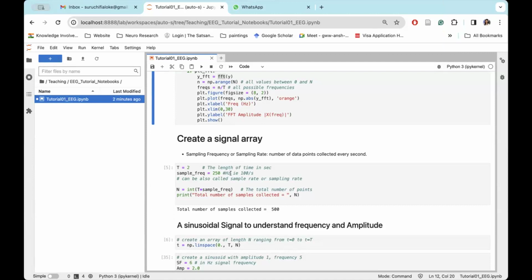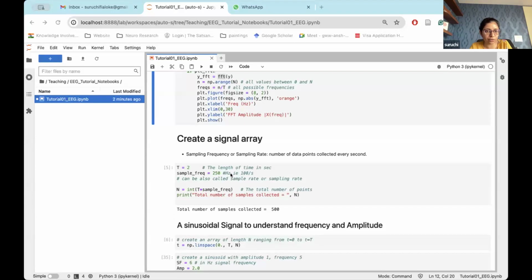Yes, ma'am, please. So it's still showing me a frequent sampling rate of 1 hertz, which cannot be how it was collected, because the paper was saying it should be collected at 256 hertz.